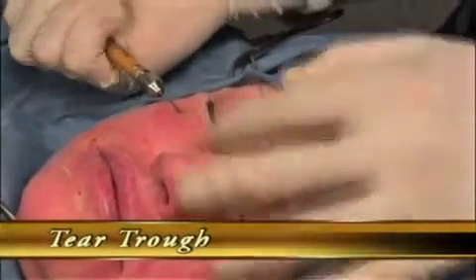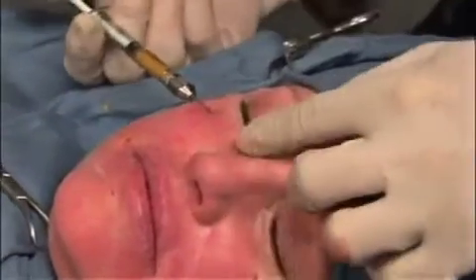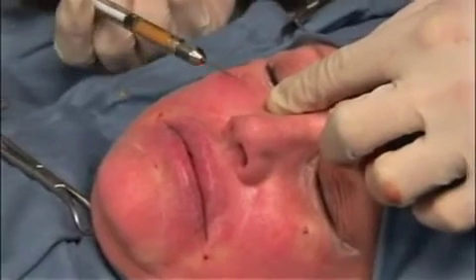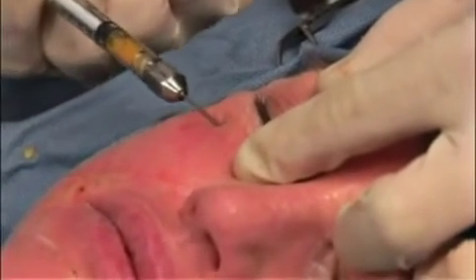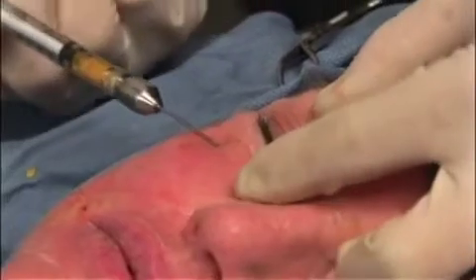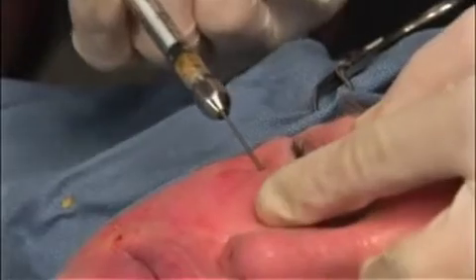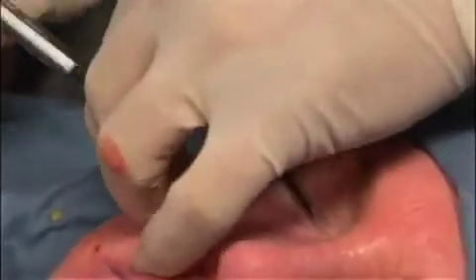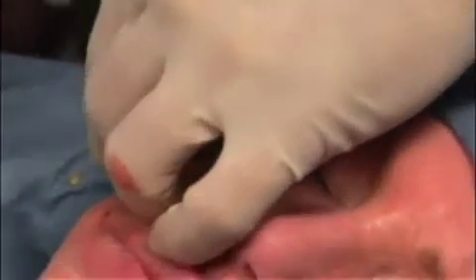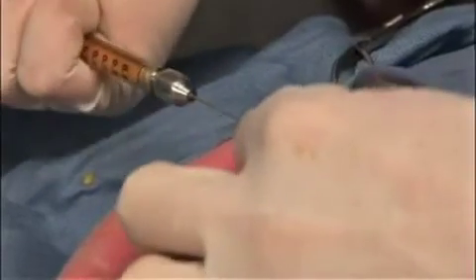The most difficult area for fat grafting, secondary to the thinness of the skin, is the tear trough area. Caution in the amount of fat injected in this area is paramount. Slow movements to and fro with minimal injection of fat is preferred. One can also use a Jaeger eye shield to protect the globe of the eye from injury.